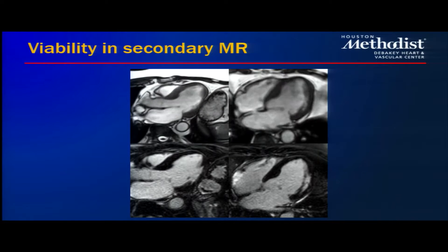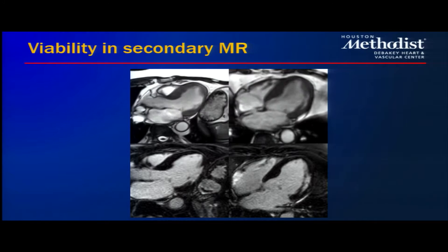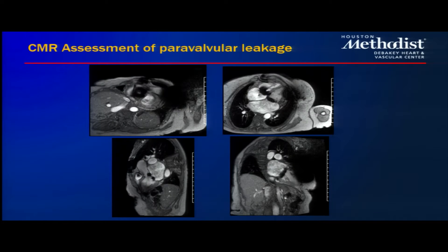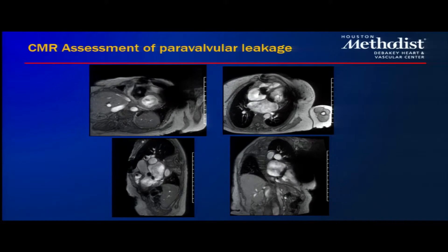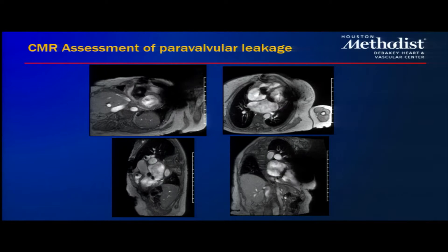For secondary MR and viability assessment, CMR can clearly show wall thinning and confirm the extent of replacement fibrosis or myocardial infarction in that region. We can also examine other mechanisms of mitral regurgitation — shown here is a case with multiple valvular lesions where there is a notable finding opposite the LVOT.